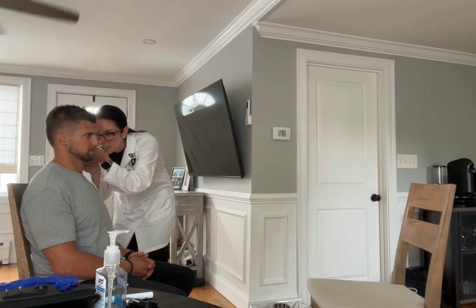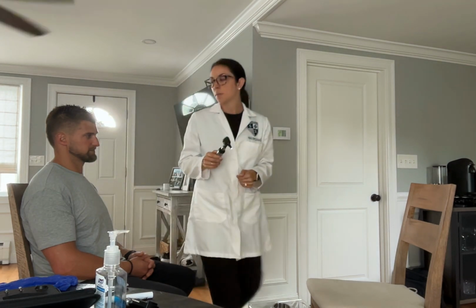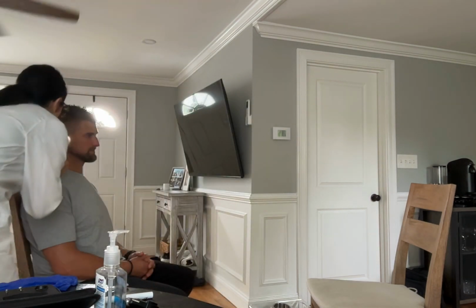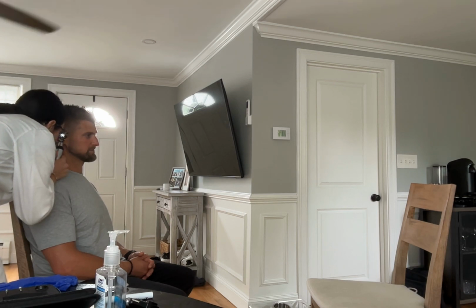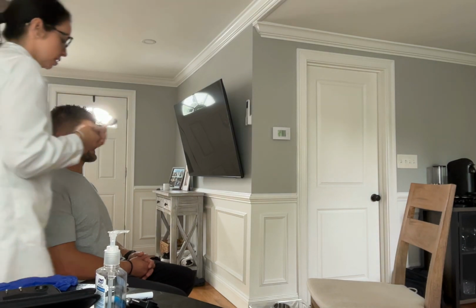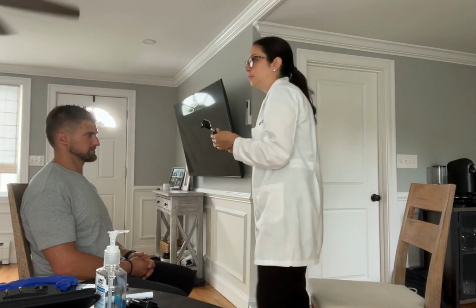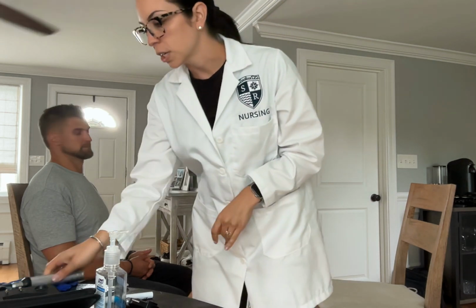Some cerumen buildup. Everything looks intact. And check the other side. A little bit more cerumen buildup. Everything looks great. Okay. And then we're going to test his hearing. So we're going to do the whisper test.